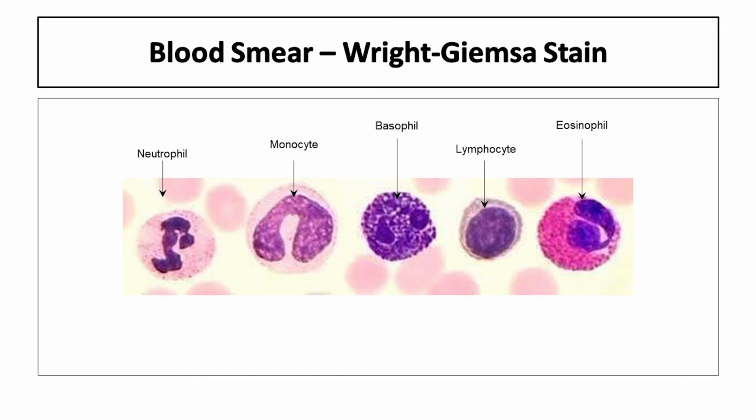The next one is monocyte. They tend to be bean-shaped, large nucleus, and large amount of cytoplasm cells. You can see that they have a very, very large nucleus and lots of cytoplasm in the center, but they often get confused with lymphocytes. Lymphocytes also have a very large nucleus, but it's very, very round. They tend to have a tiny little crescent of cytoplasm, as you can see here in this image. They don't have that much cytoplasm, so that's how you differentiate them. Lymphocytes are very round, very little cytoplasm in a crescent shape. Monocytes, large, bean-shaped nucleus, lots of cytoplasm.